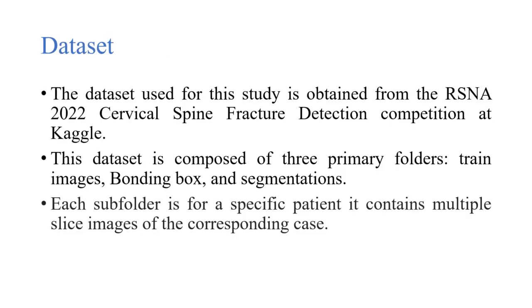Next, moving on to our dataset, which forms the backbone of our study. The data utilized in this research is sourced from the RSNA 2022 cervical spine fracture detection competition hosted on Kaggle.